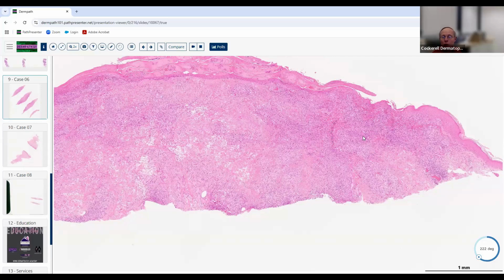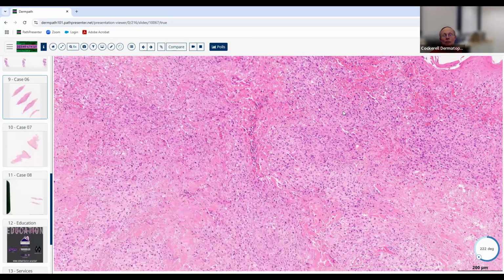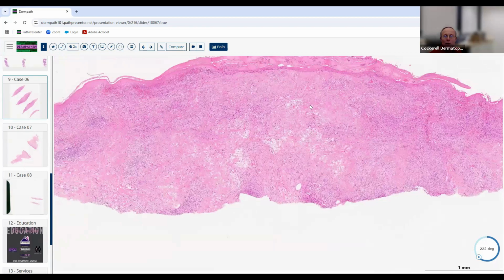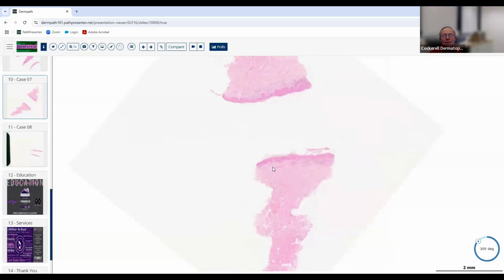If you get one that's ALK positive, you worry about the patient maybe having systemic lymphoma. And then there's a CD30 positive anaplastic large cell lymphoma that histologically can look just like this, but it's one lesion. Some of those are benign and do nothing. Others, if they have an ALK fusion, can tend to be more aggressive and can kill the patient. So this is a good example of lymphomatoid papulosis, and it's got the degenerated central area. That's classic. These things undergo this infarction, if you will, and they tend to come and go. Tough case, but you'll get it the next time you see it.